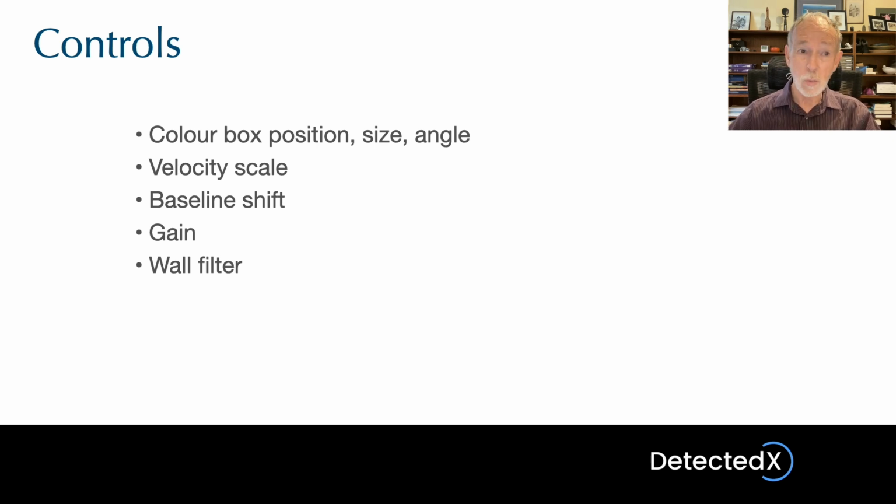And finally, there is a wall filter, as I mentioned, in Colour Doppler, as there is in spectral and continuous wave Doppler for the same reason. And you can change the setting of that if you need to.